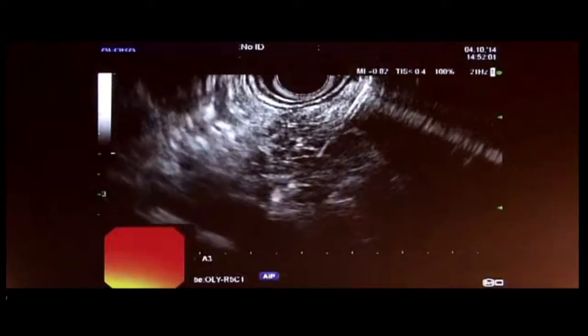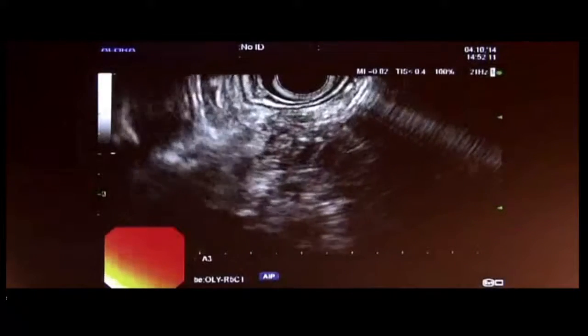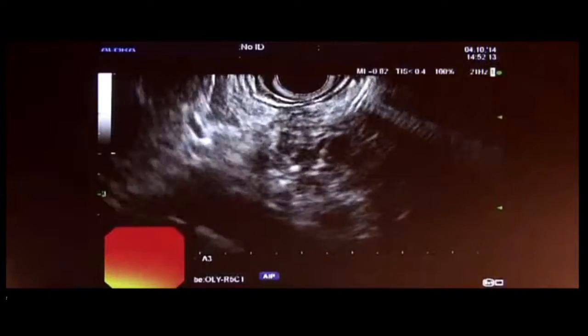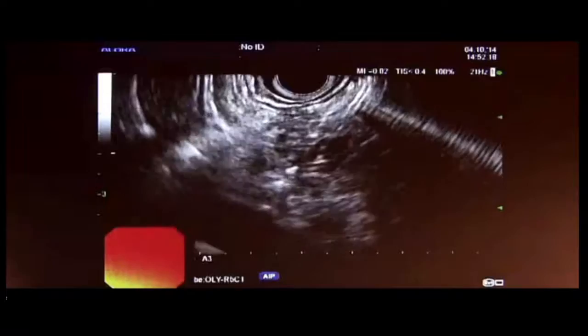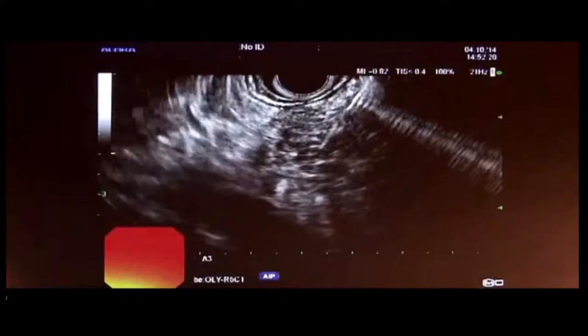Because what I'm going to do is just slowly pull the needle back. What's happening? Something's going on with this. Yeah, we don't want to keep losing the US image like that. Okay, I'm pulling the needle back. See, I'm really nicely inside. Yeah, that looks great. One moment here. I'm nicely inside. You can see I'm smack in that duct. And now we can start injecting.